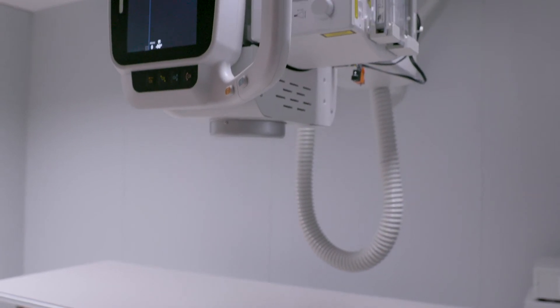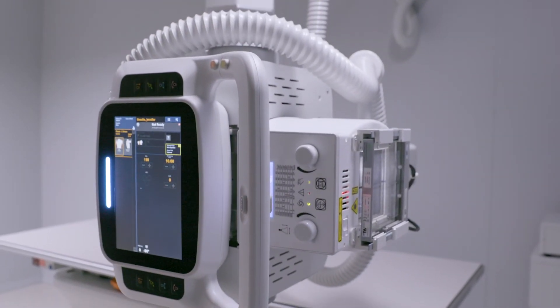Auto-tracking reduces the fatigue that can happen while operating an imaging system and lets radiographers like me focus more on our patients.